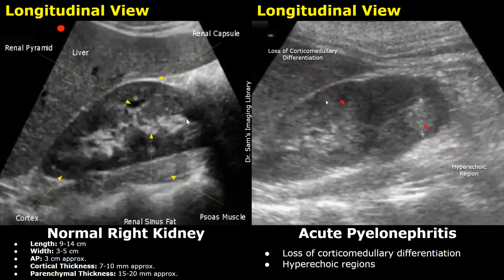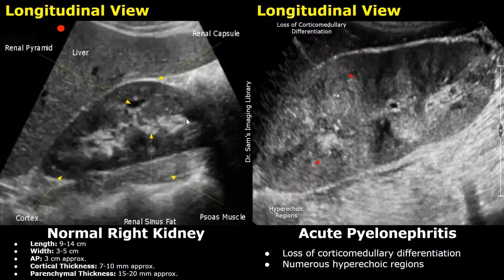This is another case of acute pyelonephritis of the right kidney. There is loss of corticomedullary differentiation, and we can also see hyperechoic regions within the kidney. There is a focal hyperechoic region at the lower pole. This additional image of acute pyelonephritis also shows loss of corticomedullary differentiation and numerous hyperechoic regions. These findings, if seen with high grade fever and flank pain, do suggest pyelonephritis.